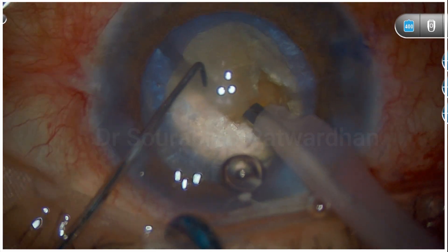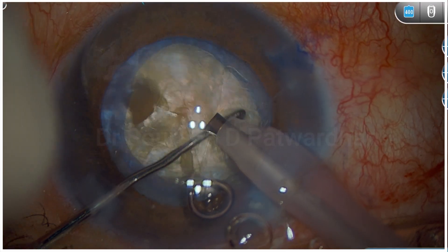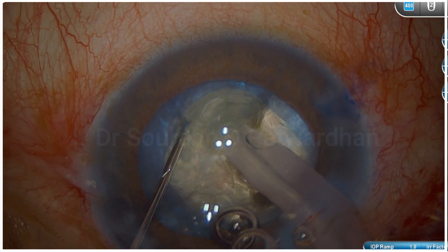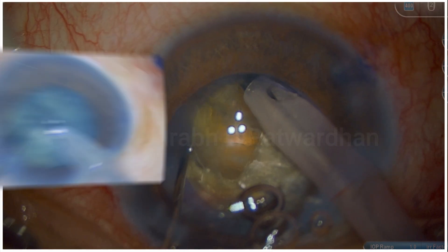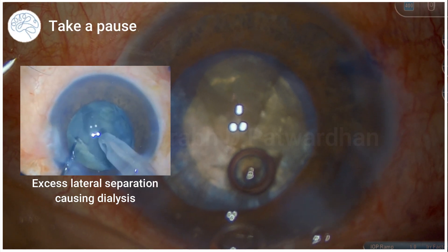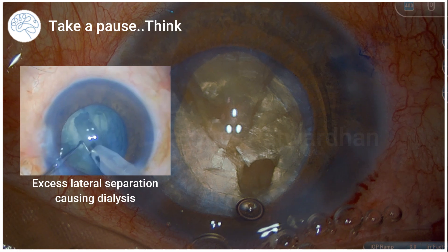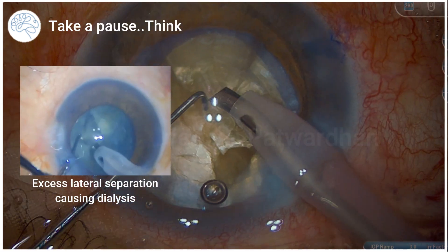When the surgeon sees that the posterior plate is not completely cut, the surgeon decides to go to another point, go a little bit deeper into the nucleus, and try to do lateral separation again. One thing the surgeon is doing correctly is not trying to separate too much, because when you stretch it too much — as I've shown in older videos — it can cause a PC tear or dialysis. So rightly, the surgeon just took a pause, injected more OVD, and brought in the thought process.